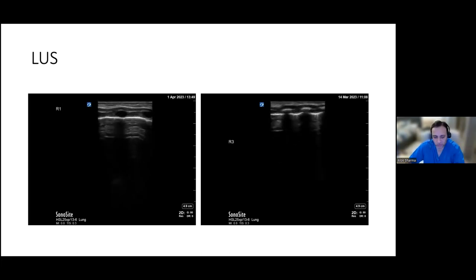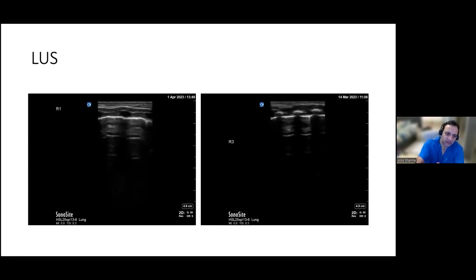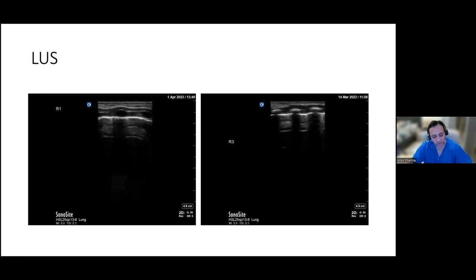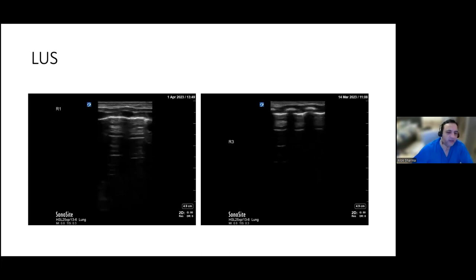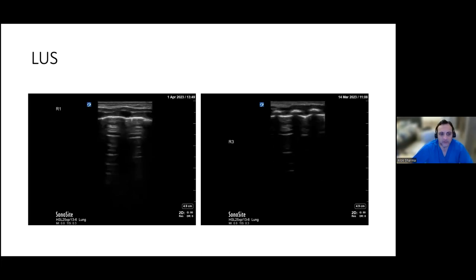Most Sonosite machines have what is called an i-gain. An i-gain basically means that when you take your probe, you gel it and you place it in contact, it will automatically try and adjust the gain to give you the best image. With the contact on, if you press i-gain, it will automatically adjust your gain to give you a uniform image. If it's not there, then I would agree that you'll need to use either the spatial gain or horizontal gain, which basically means you'd be trying to increase the gain in the lower half of your image. The upper half of the image looks perfect.